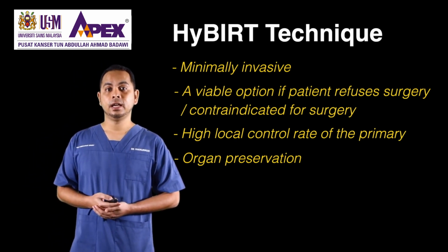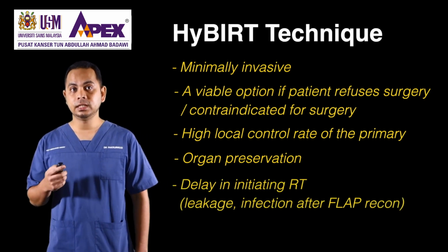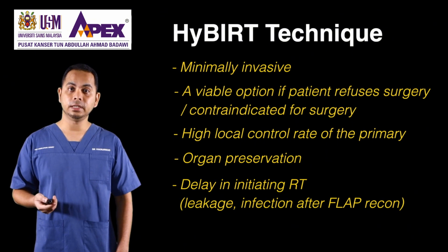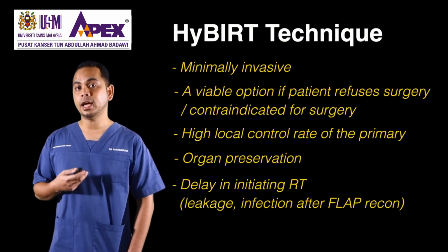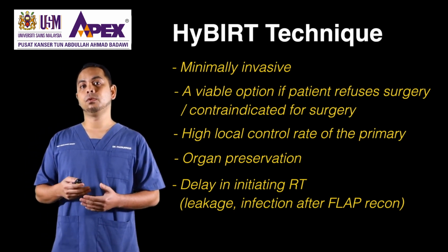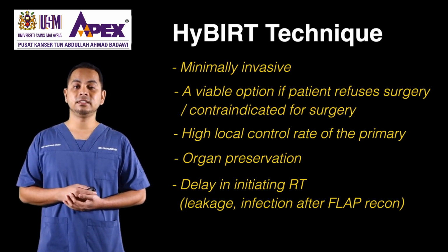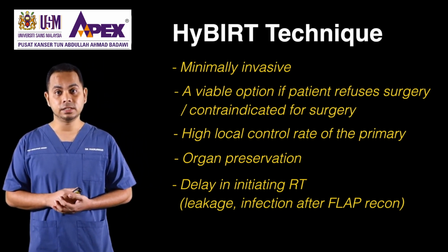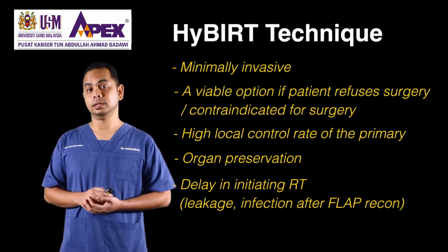With surgery, sometimes we need to delay the initiation of radiotherapy in view of possible leakage or infection, and we have to wait for the patient to completely heal from surgery before we start radiotherapy post-operatively. And this is currently the only center in Malaysia doing oral brachytherapy.